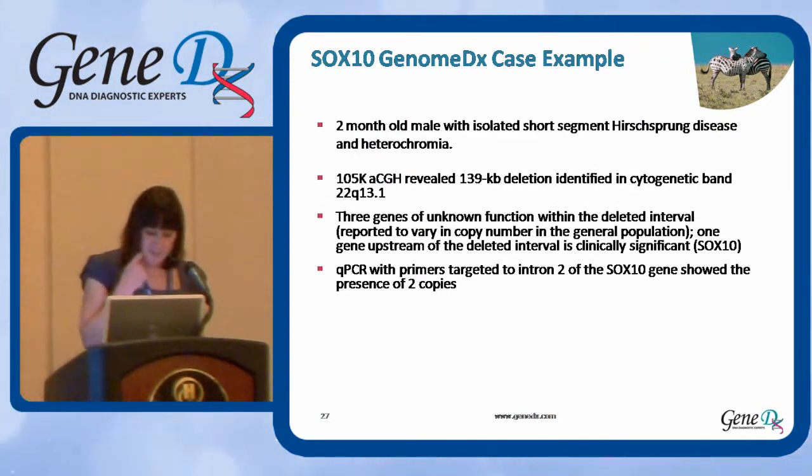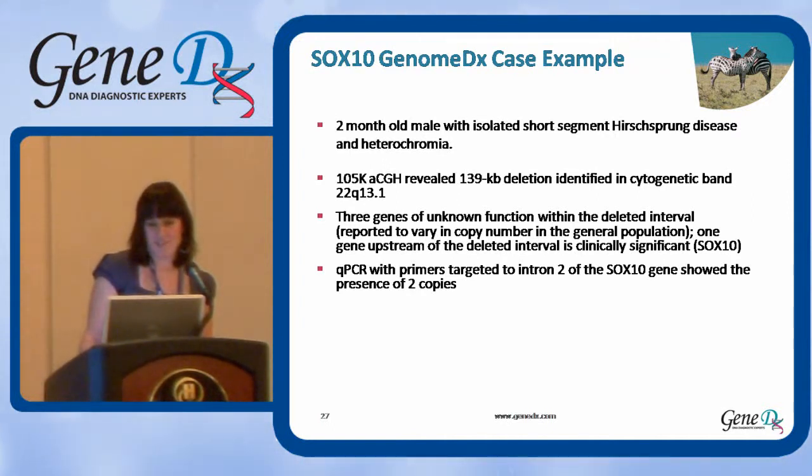Here's a really good Genome DX case example that came across recently that highlights the utility of the genome-wide applications, as well as a friendly reminder for all of you to please include clinical data on your laboratory requisition form. This case came to us with a 2-month-old male. There was no clinical information provided on the requisition form.